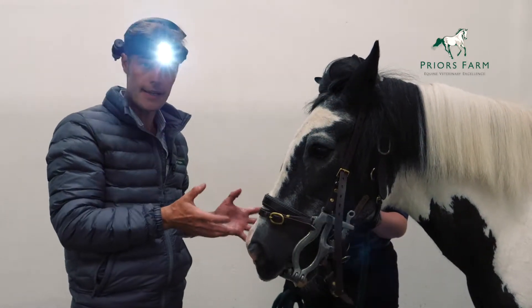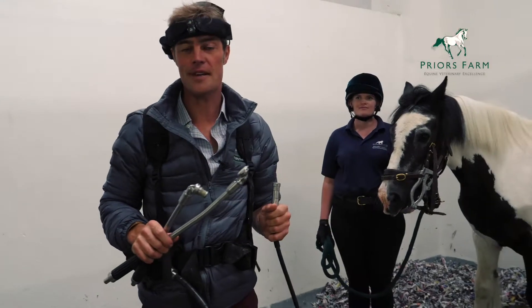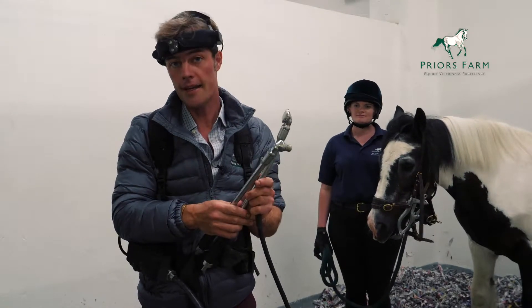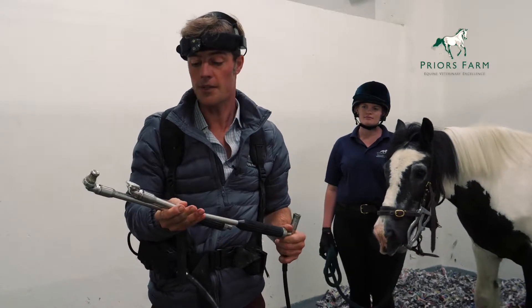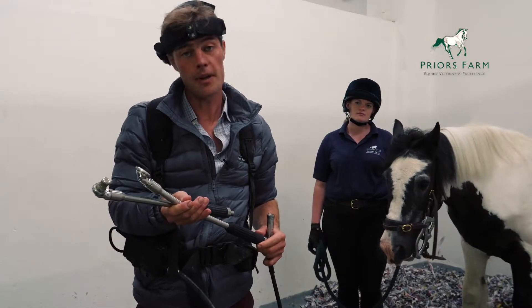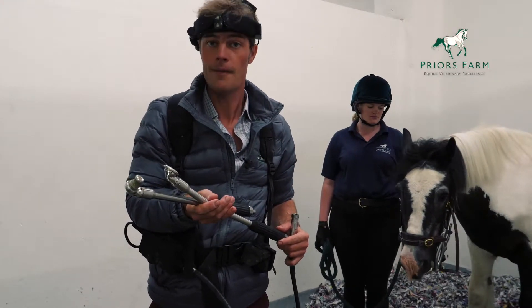If the horse then needs his teeth doing, we use the mechanical dental grinder. Each vet in the practice has their own mechanical dental equipment. They come with two burrs routinely to allow us to correct any dental abnormality within the mouth. We are finding that horses tolerate this kind of equipment much better than the traditional handheld floats or rasps, because it's much gentler. So the horse benefits.